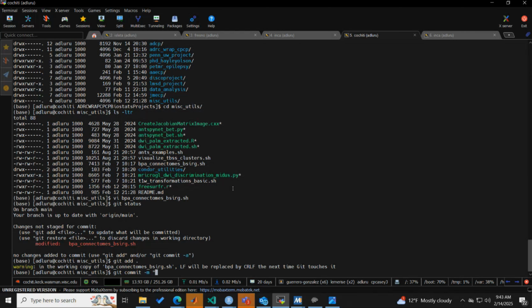So it's not a surrogate for volume. Think about this. Log Jacobian is a morphometric analysis, not a volumetric analysis. It's a change in volume analysis. It's not volumetric, so those are two distinct things. A big region can shrink a little bit, which means its log Jacobian will be small. A small region could shrink a lot, so its Jacobian could be big.